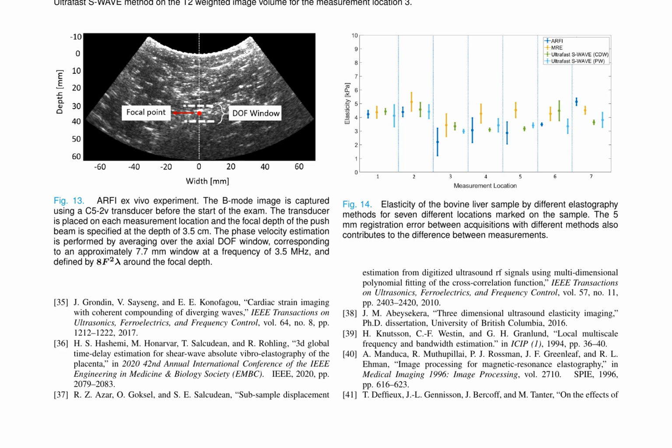In conclusion, the integration of MR T2 weighted images with elasticity volumes offers a powerful tool for researchers and clinicians, enabling them to explore the complex interplay between tissue elasticity and anatomical structure in various contexts.